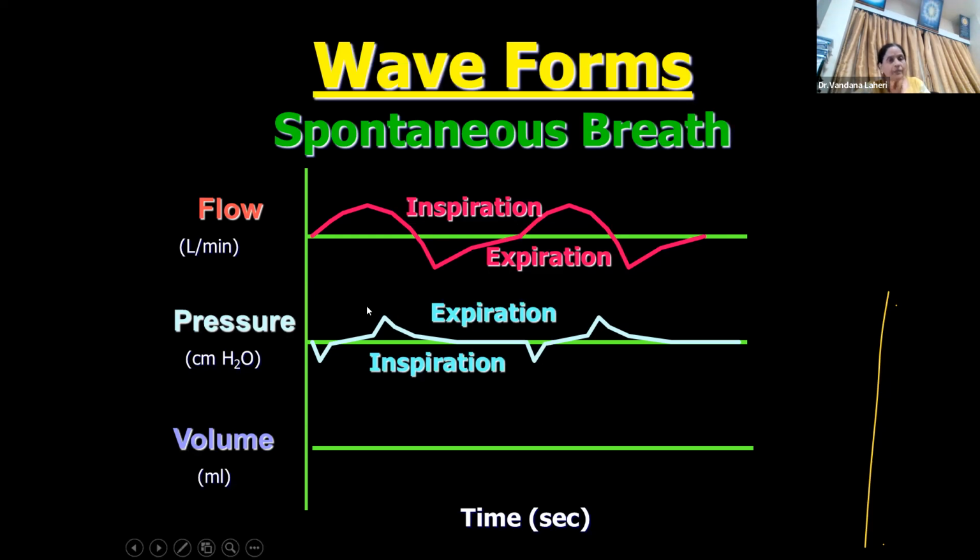Now, if you look at the pressure graphic, pressure versus time. This is time, this is flow. Flow is in liters per minute. Pressure is always in centimeters of water, and volume is in ml. If you look at the pressure graphics of a spontaneously breathing patient, during inspiration the patient creates a negative pressure, which is registered here.